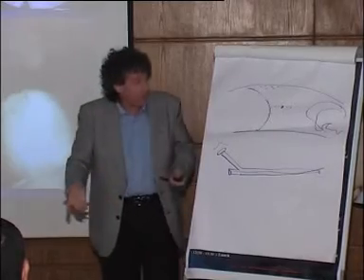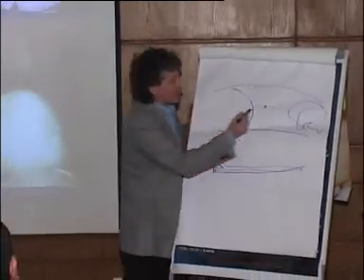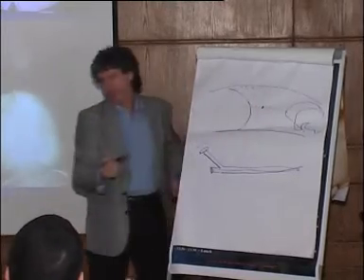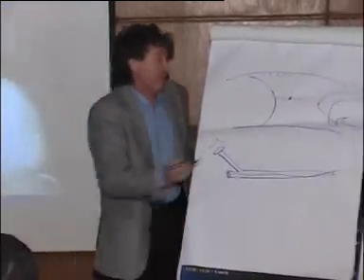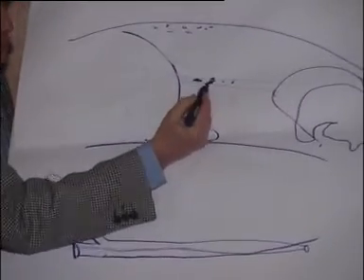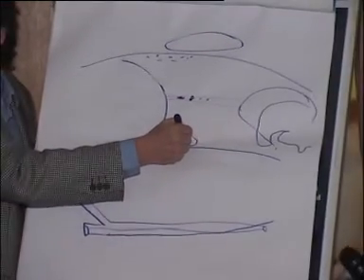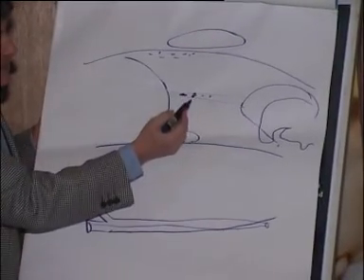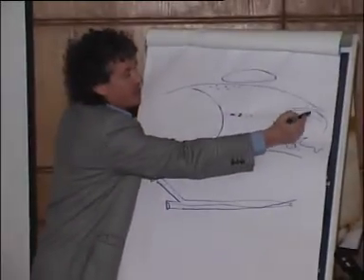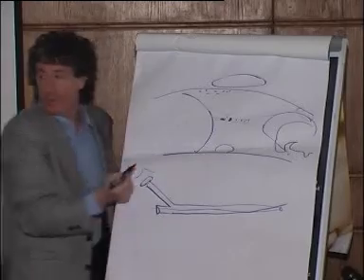For sure, if you need a second point of entry, 99% of the procedures will be like this because the lesion will be here. But if you have a lesion here, of course, you do the same thing, but you make a round. You will be here in order to sample here. You understand? If you have, for instance, a lesion here and it happens, you try your best to have your forceps here in order to see what's happening, etc. But it's an insufficient number of cases. Okay?